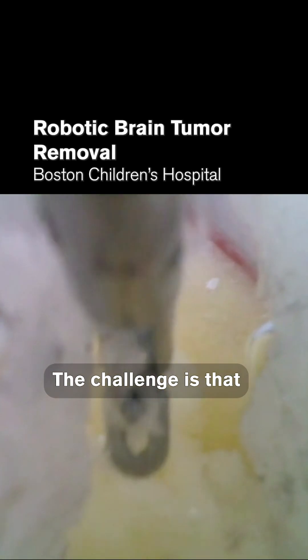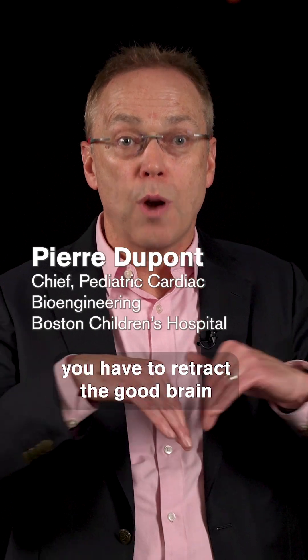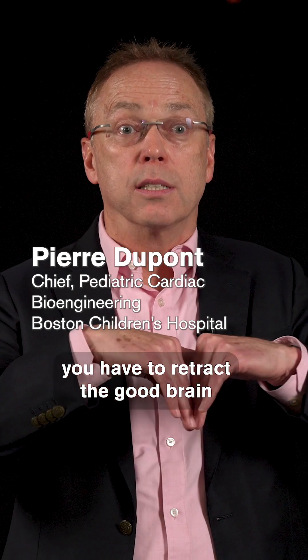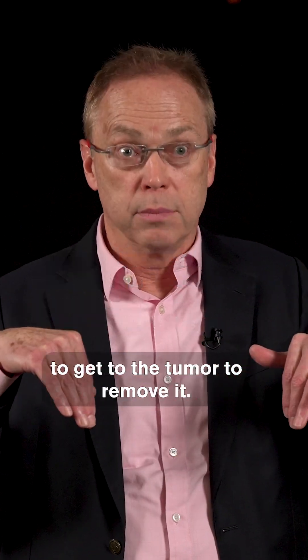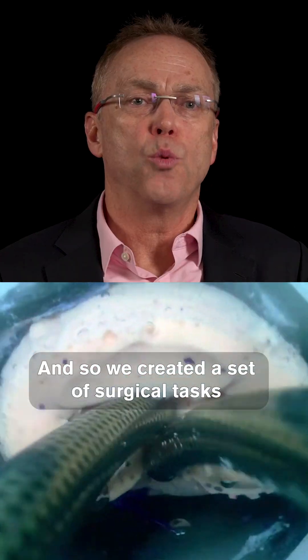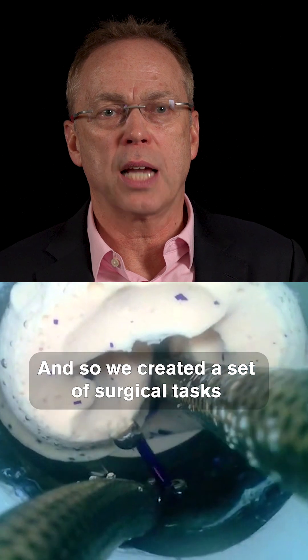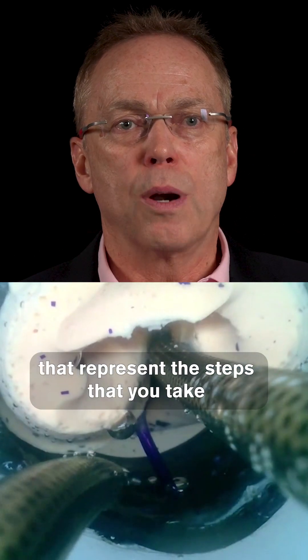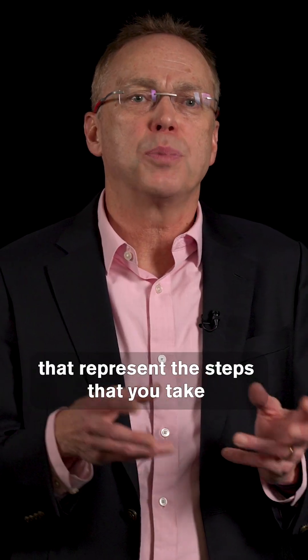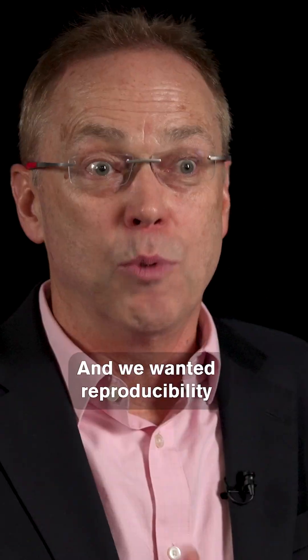We created this robot for brain surgery. The challenge is that you have to retract the good brain to get to the tumor to remove it. And so we created a set of surgical tasks that represent the steps that you take in removing a tumor from the brain.